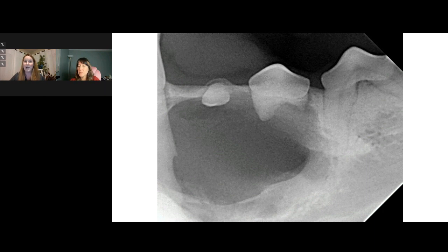However, the biggest thing that I run into is when technicians learn to only take radiographs when their patients are in sternal, but the doctors only know how to take teeth out with the patients in lateral. If you want to know whether or not you have all of the tooth out, you have to flip your patient again in order for your team to know how to take a radiograph to see if you have a retained tooth root. And if you do, then you have to flip them back to lateral, and then you keep working, and then you want to know again if you got it all, and then you flip them back to sternal. And as you can see, that is going to lead to, let's just not take the rad, I'm sure it's out.